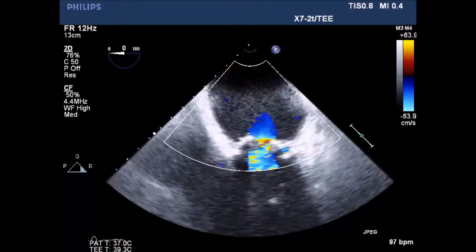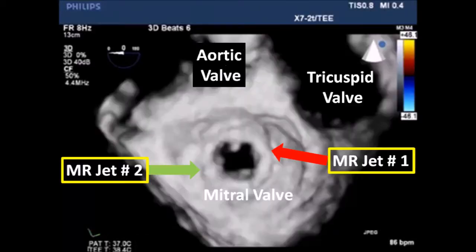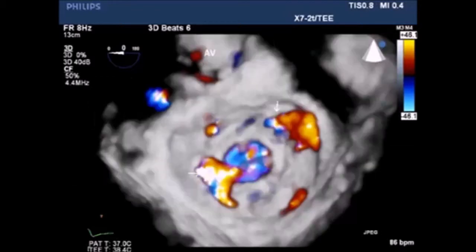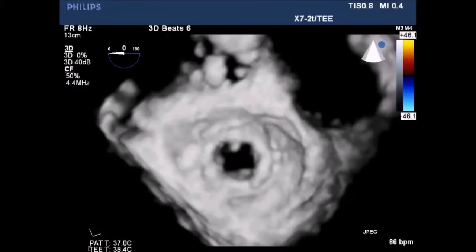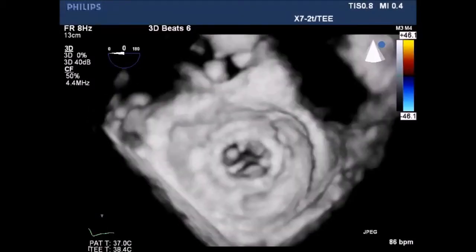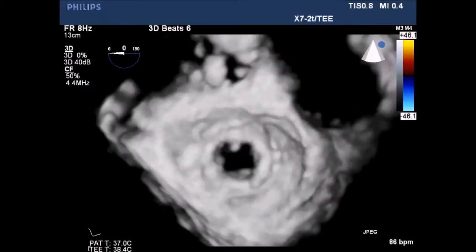There was no significant gradient across the mitral valve. There are several 3D views — note the position of the aortic valve to keep oriented. Two distinct MR jets: one at one o'clock and one at nine o'clock from the surgeon's view.